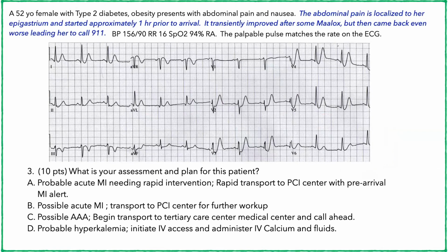But the most important thing that we talk about is we review all those things, right? But really, the differences between these T wave abnormalities are subtle, and the reality is none of those things are 100%.